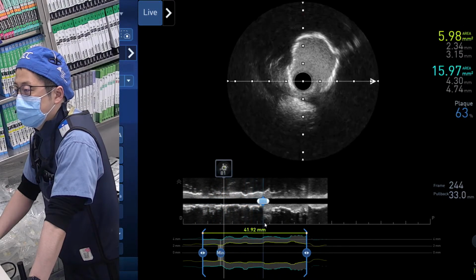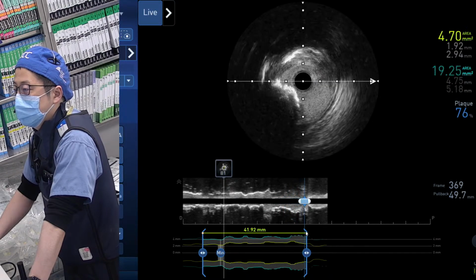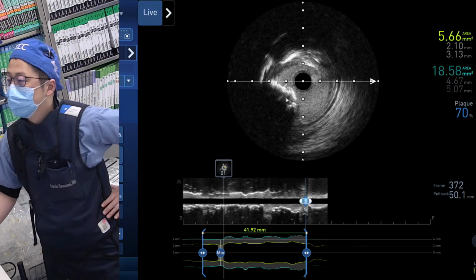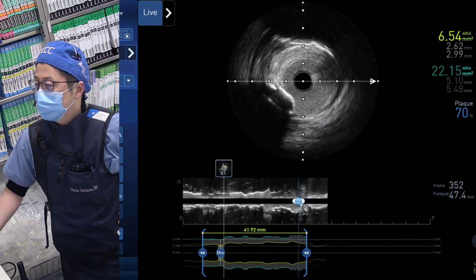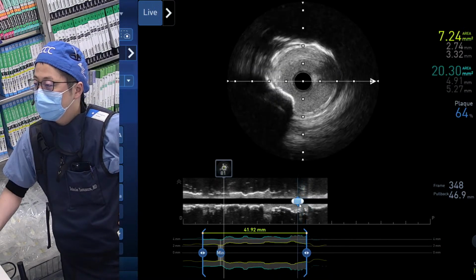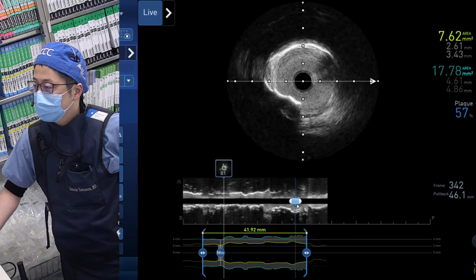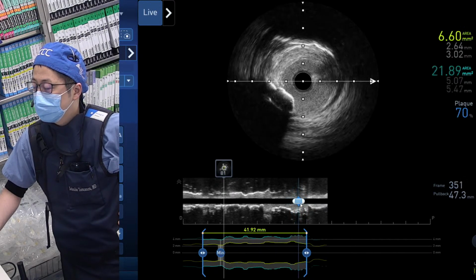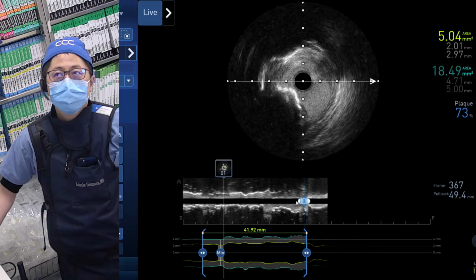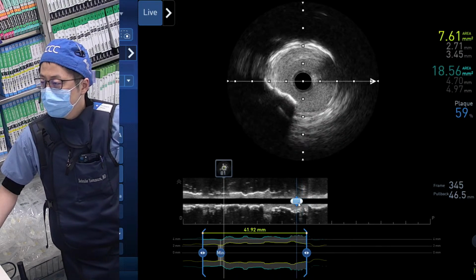So by IVL, a lot of fracture there, but still a lot of calcium there. And the left main nodule is still sticking into the lumen. IVL didn't do anything. Too small, sure, but by IVUS you were not sure. You didn't really put the IVL there. Not ostial, we did distal left main. You were more in the ostium of the LAD. But we wanted 3.5, 3.0, so your waves are not reaching, I think.